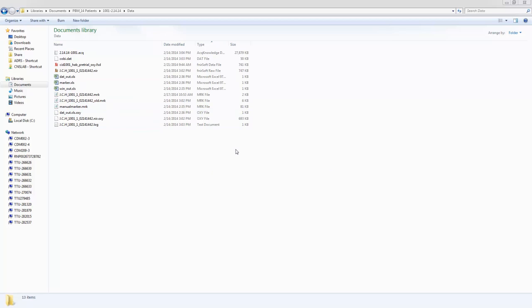There are multiple pulses: one to start the picture, one that tells you where a startle probe was initiated, and lastly one indicating the picture is off. The pre-processing and cleaning element is where we go in and take out everything other than the picture on. That's all we need for the fNIR processing.